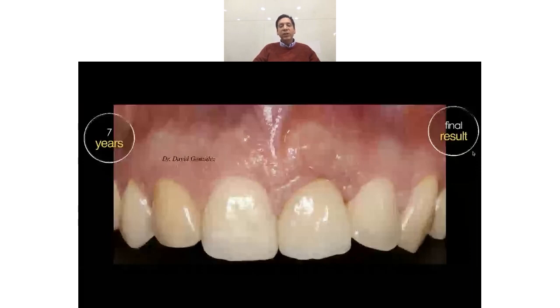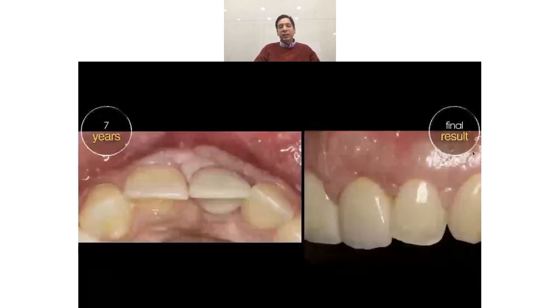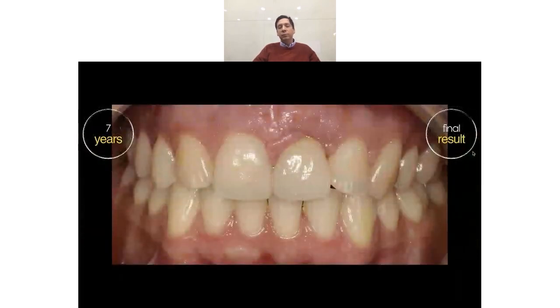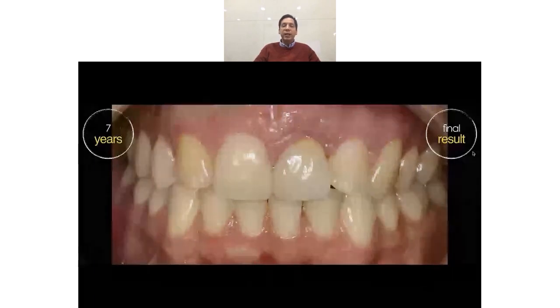And this is the aspect 7 years later. 7 years later, we see that we have a small papilla, and we see this aspect. We see the lateral view, and this is the frontal view. You can believe me that I have said to this patient many times, let me place a CTG like an envelope. It will be a quick operation. And he always says, I'm very, very happy with the result. I don't need any more. I'm very happy. I smile fine. So this young patient now is 31 years old and he's very happy with the result. Is the aspect 7 years later.